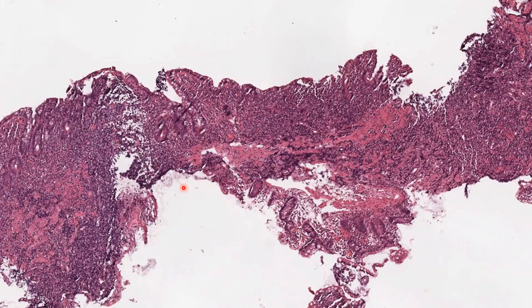you can see the surface irregularity. If you are using surface irregularity as a landmark for ulcerative colitis, as we talked about before, you get a lot of surface irregularity in the biopsy, but here you cannot use it, okay? So you are handicapped. A lot of the features which we used to use, we are not able to use again.